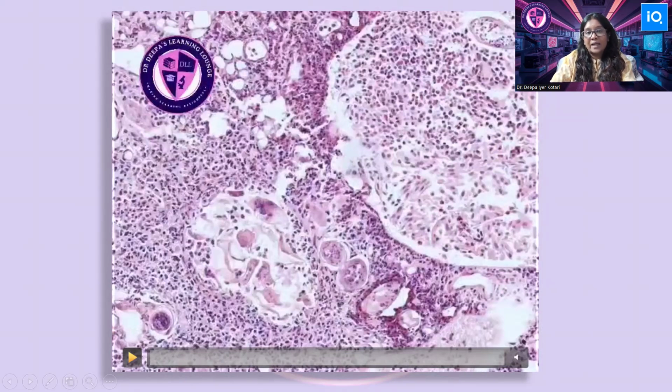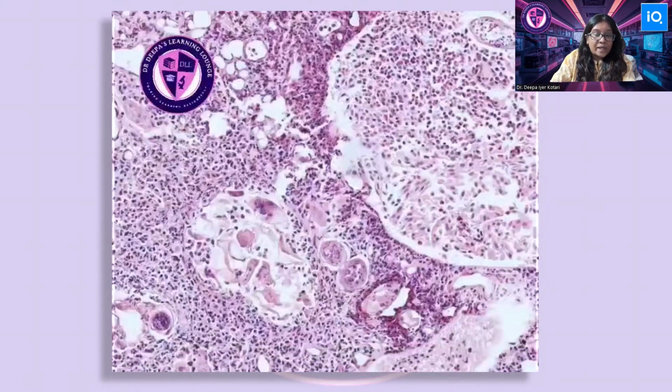In an early active disease like the one I have shown you, the bladder mucosa will show marked edema and congestion and a dense eosinophilic infiltrate. There can be a mixture of chronic inflammatory cells here and there, lymphocytes and some plasma cells. Microabscess formation is generally seen when the eggs become entrapped in the bladder. That is when you find a microabscess kind of picture.